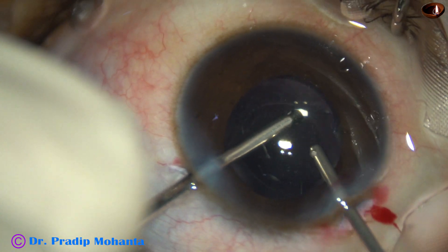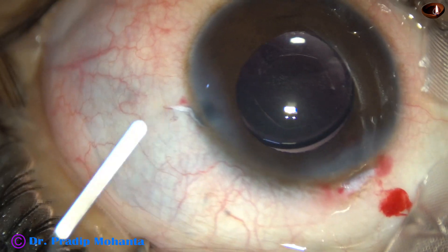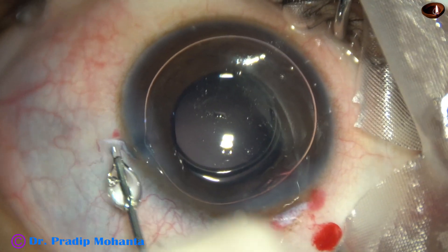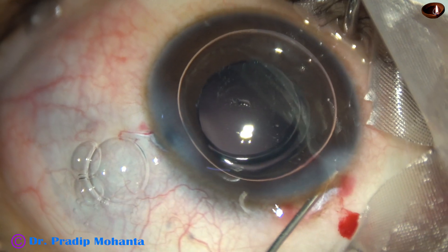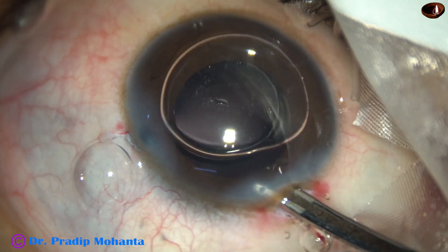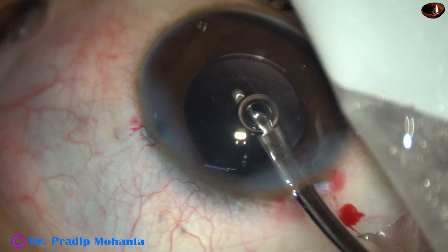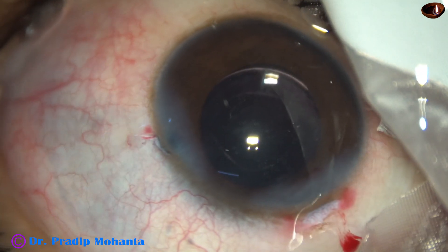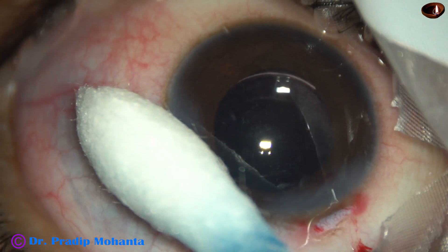Now I am happy — it appears neat and clean, but I have to close the side port again. An air bubble is used to form the anterior chamber. In children, the anterior chamber tends to collapse because of low scleral rigidity, so I use an air bubble to maintain it. After hydrating the corneal stroma on either side of the wound, the main wound has gone posterior to the limbus and no suture is needed.